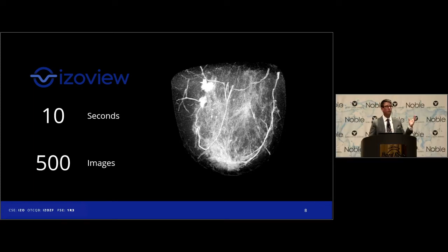You can see those 2 highlighted spots. They can see what's around it. They can see the interplay between blood vessels and the different ways it grows. And there's a paper that recently came out looking at the morphology of tumors and indicating what type of tumor it is. And this is the advent of 3D imaging.